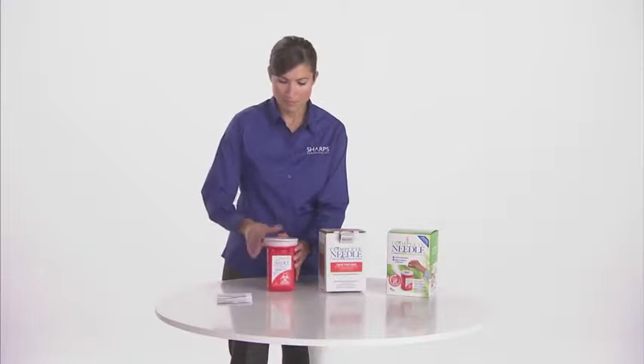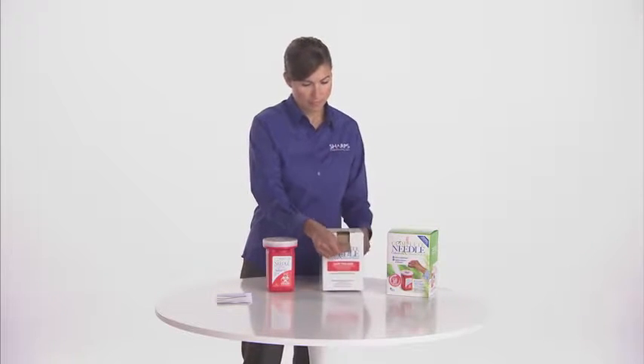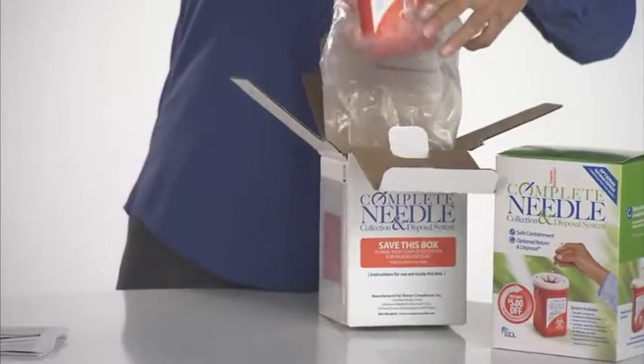Always purchase a new Complete Needle System before returning your full system for proper disposal. Once the container is ready to be disposed, secure the lid. If you choose the return and disposal option, follow the instructions for use for packaging your container.